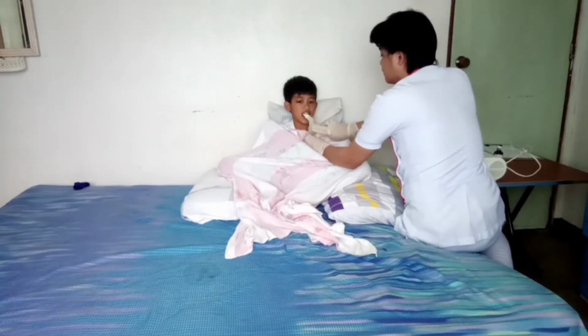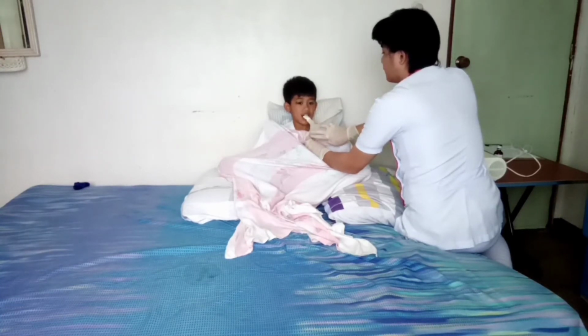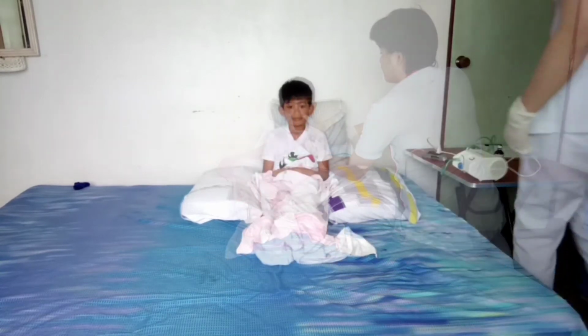Keep the neb cup as upright as possible during the treatment. Gently tap the cup every 2 to 3 minutes to move droplets of medicine to the bottom of the cup. This is to ensure the patient receives all the medicine.